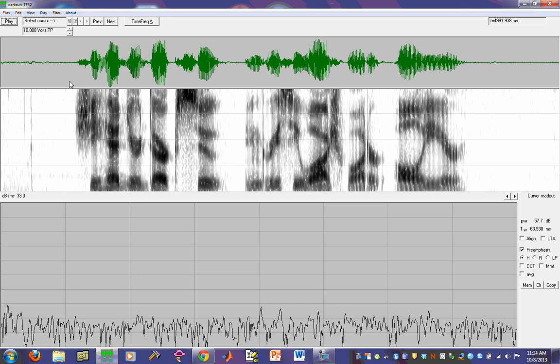Again, on the top we have the sound pressure waveform, in the middle we have the wideband spectrogram, and now on the bottom we have a spectral display that's going to be providing information about what the short-term spectrum is around the left cursor. Right now, this is associated with the very beginning.